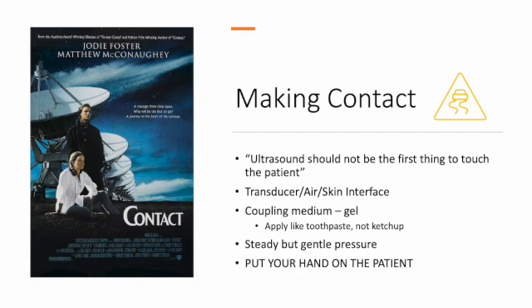Anyways, I used to have a mentor who told me, Ryan, the ultrasound should never be the first thing to touch the patient. What she meant by that was that I should always be augmenting my physical exam with ultrasound. So before I put the ultrasound probe on a patient, if I'm going to look at their heart, I should listen to the heart. I should palpate and feel where the heart is and feel that point of maximal impulse before I place the transducer down. While I'm guilty of not always doing that, every time I'm having trouble generating the image I'm desiring, that's usually what I go back to. I hear her voice in my head saying, hey, that should not be the first thing to touch the patient.